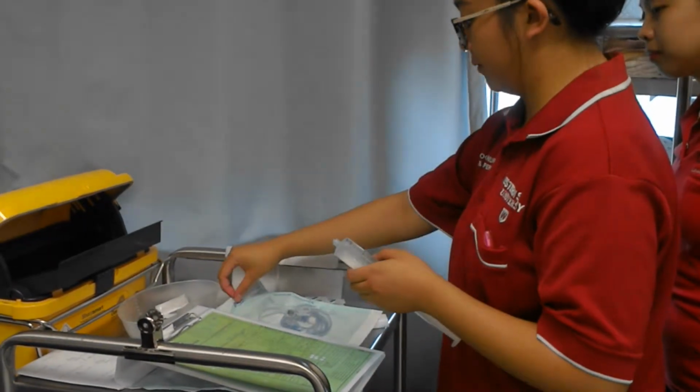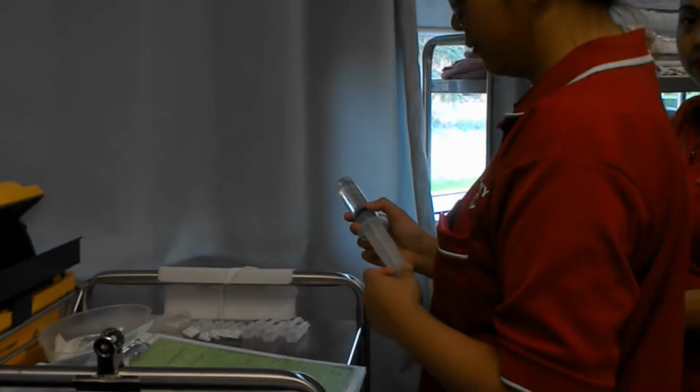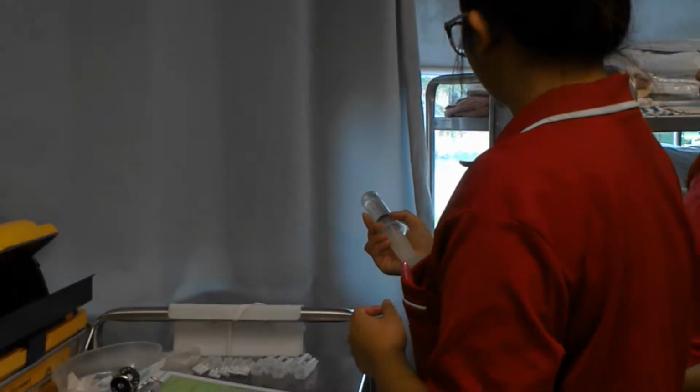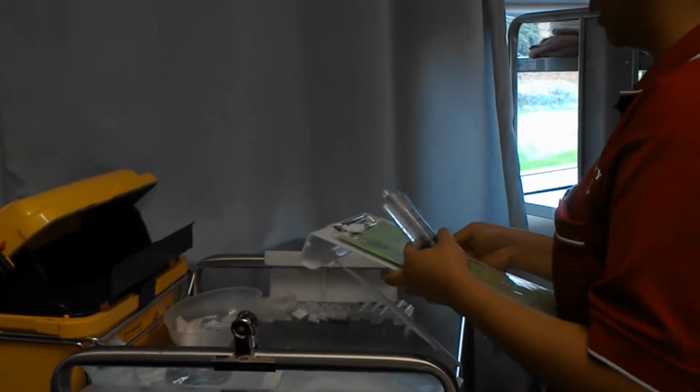Okay, and I'll just do my second drug check now. Do you mind checking if this is 50 mils for me, second nurse? Okay, and I'll do my second drug check now as well.